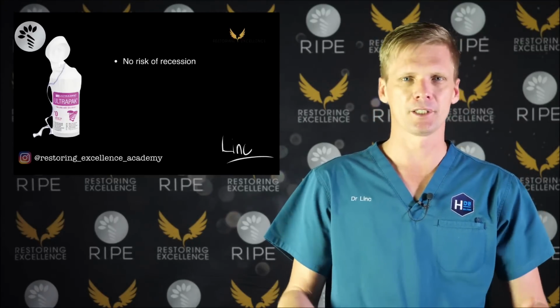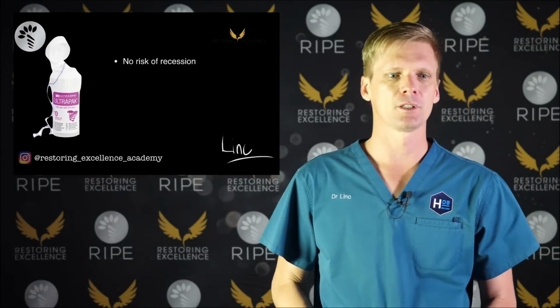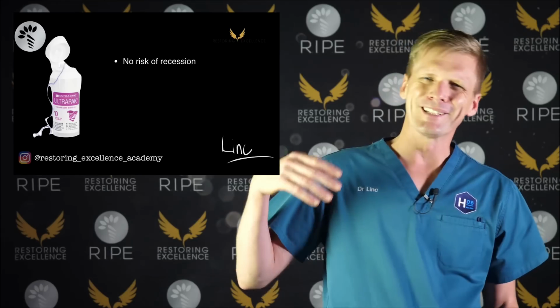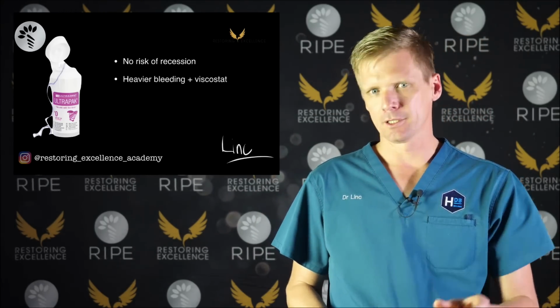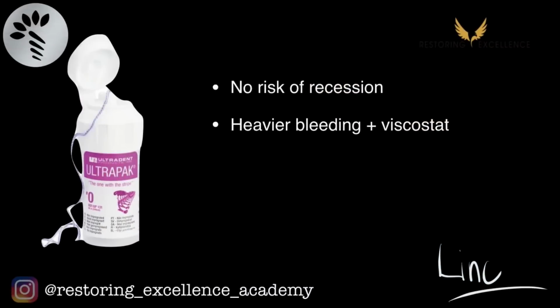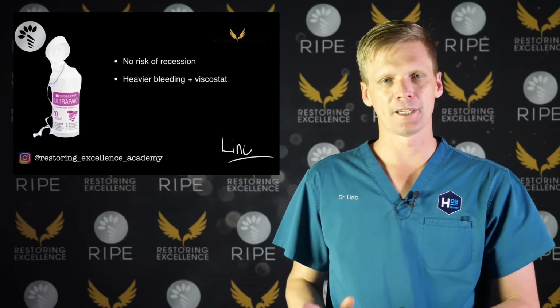Thick cord, I'm really going to use where the tissue is really thick, so you're not going to cause recession. Thick biotype, you're not going to cause recession, or where you've got plenty of buccal bone, you won't cause recession. Pretty much any time where the bleeding is heavier. A lot of the time you've prepped close to the gingiva and you've hit the gingiva with the burr, then you're going to use a thicker cord, and I'm going to soak it in Viscostat as well. Now sometimes I will pack thick cord on its own just so I can place a core. So it's just to control the tissue while I'm placing a core.